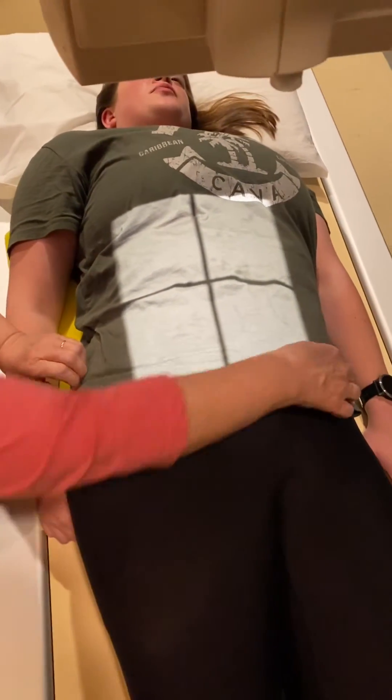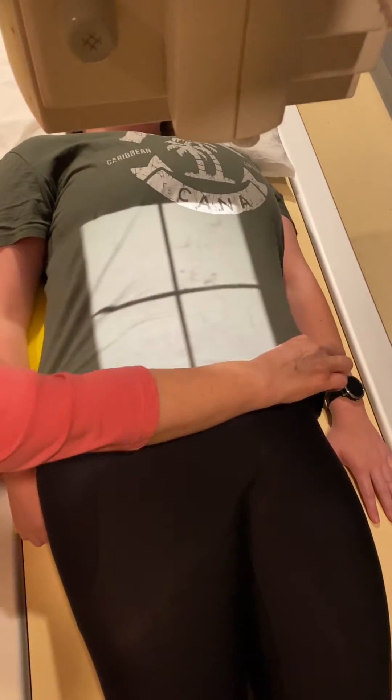So now our central ray is at the level of crest, about one to two inches away from mid-sagittal on the elevated side. And I'm going to go with that. And this is our LPO.